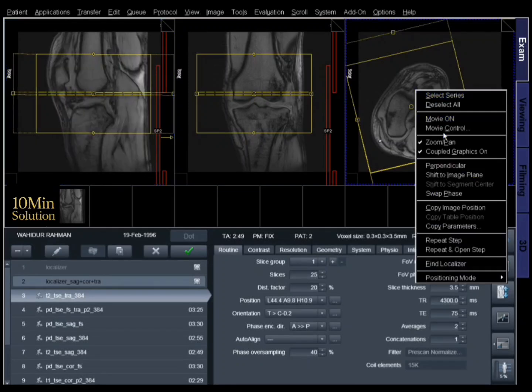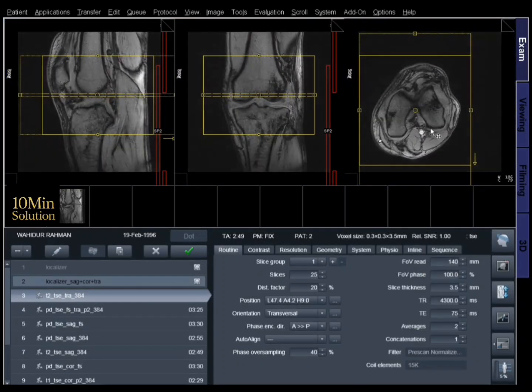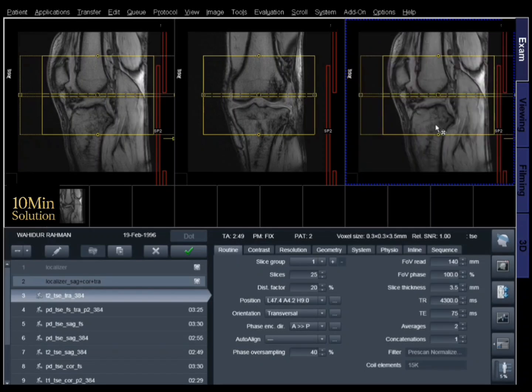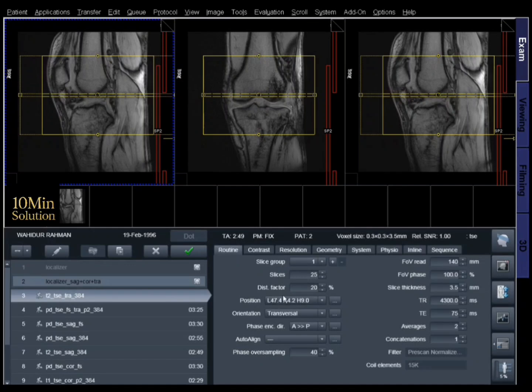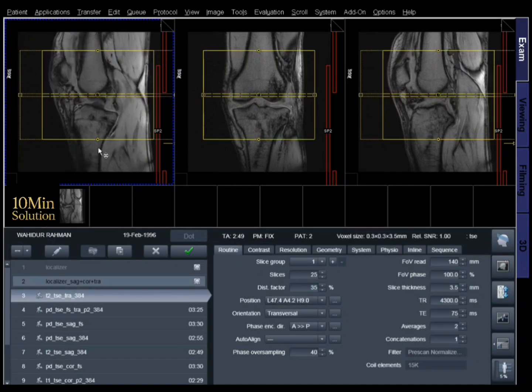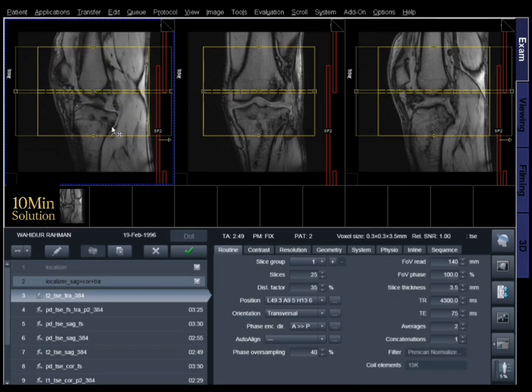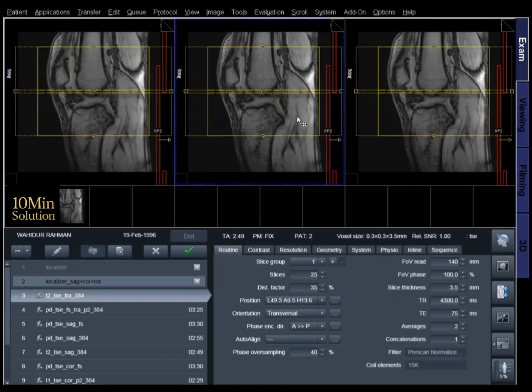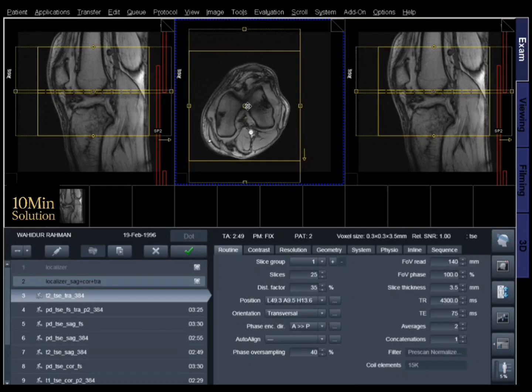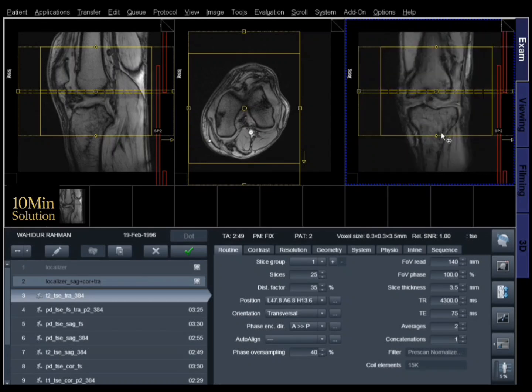This video demonstrates an MRI examination of the left knee, which is a highly sensitive and accurate imaging modality for comprehensive evaluation of the knee joint and surrounding soft tissues. MRI allows detailed assessment of the osseous structures, including the femur, tibia, and patella, as well as the bone marrow signal, helping to identify bone contusions, occult fractures, or marrow edema.